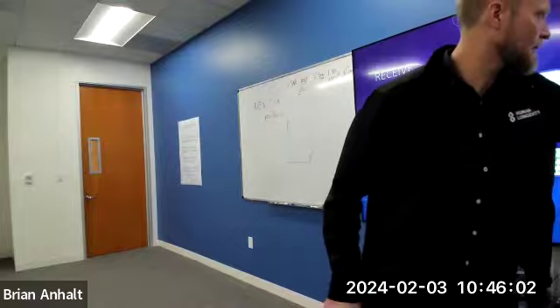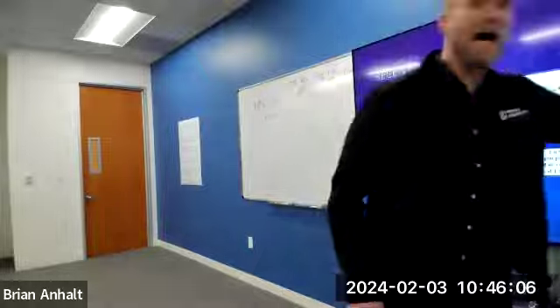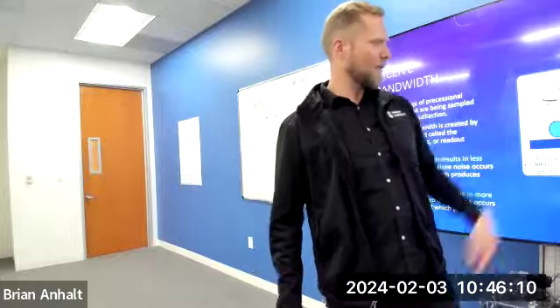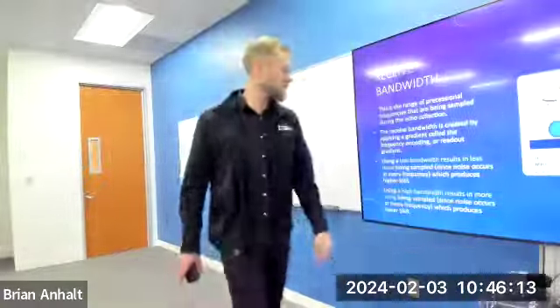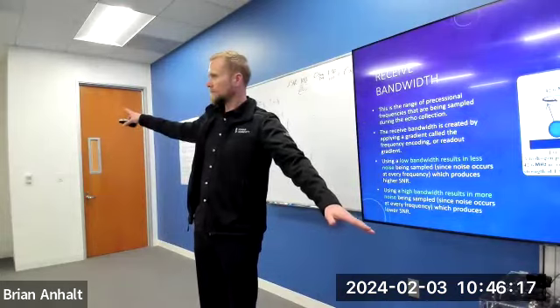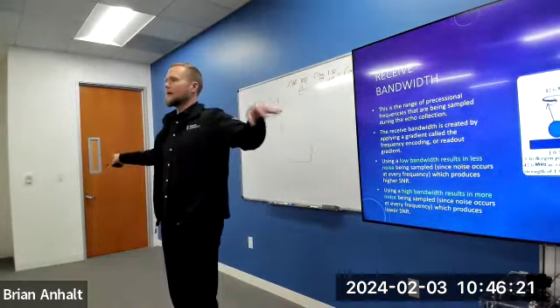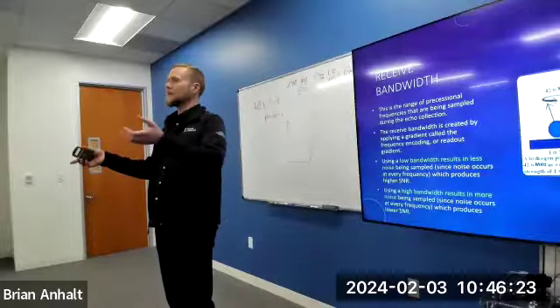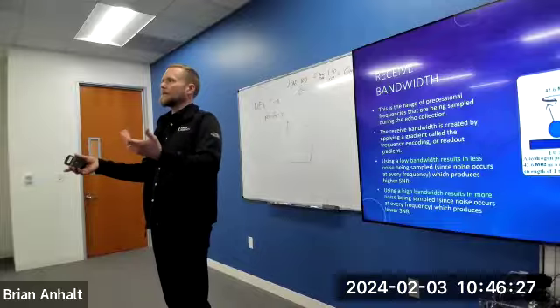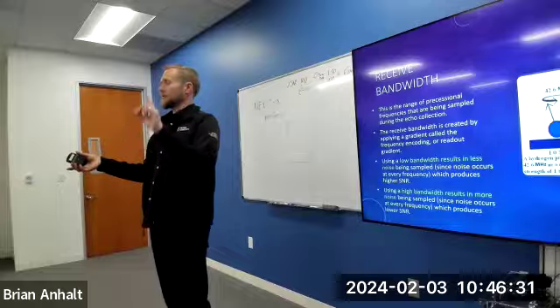This is our center frequency. And if our gradient's on, as we move up the gradient, we're going to have higher frequencies, right? And we are sampling that during echo collection. This is what we are doing. So the receive bandwidth is created by applying a gradient, right? During echo collection. If we didn't apply a gradient, the frequency we would be sampling would be 42.57 in a 1 Tesla magnet. Is that a bandwidth? It's just one frequency.